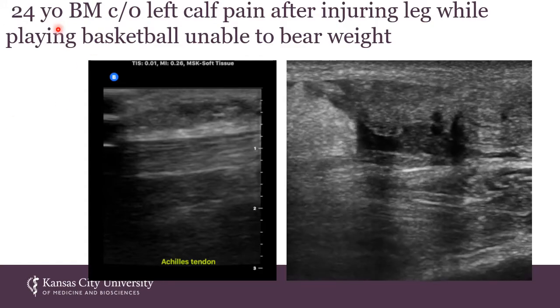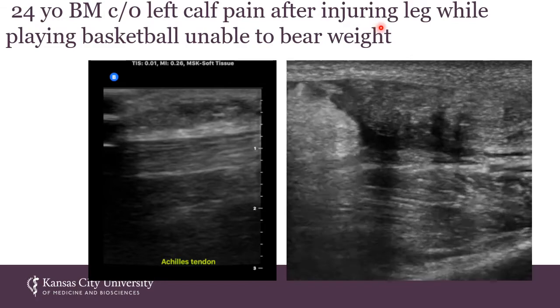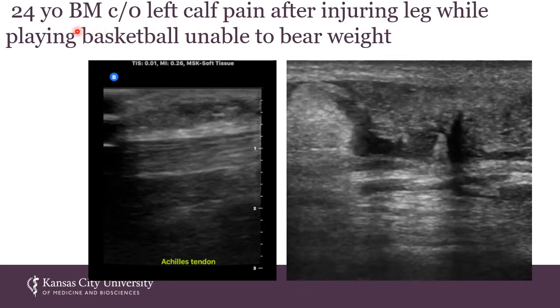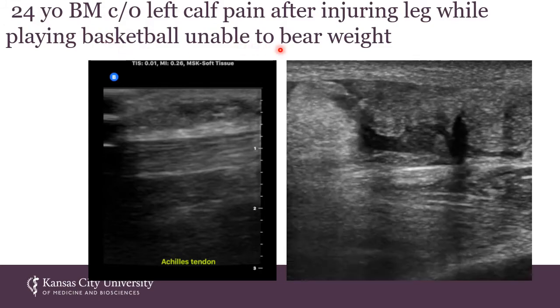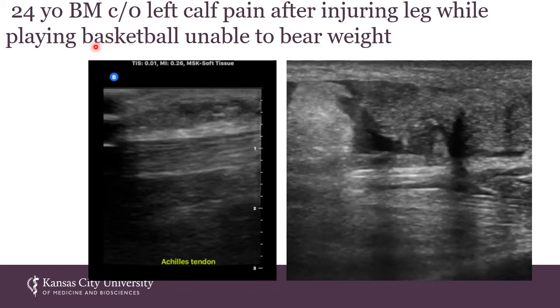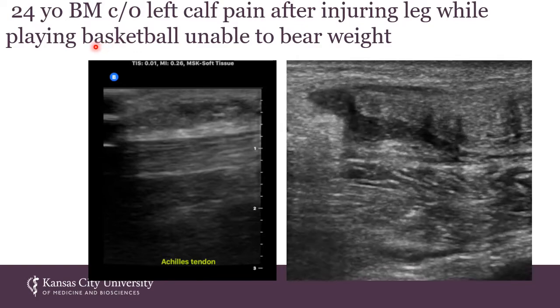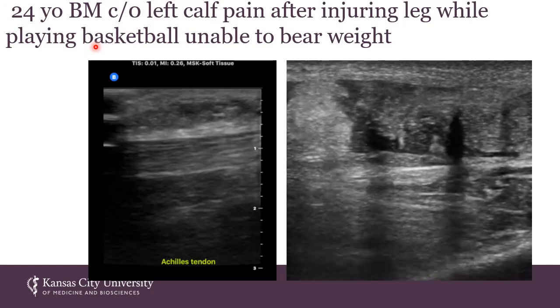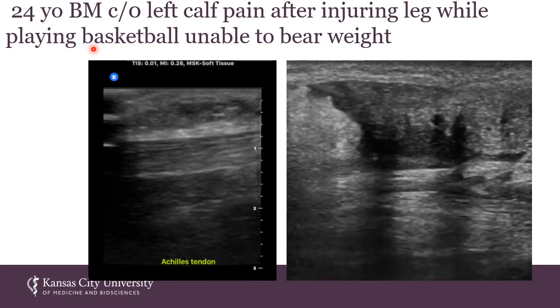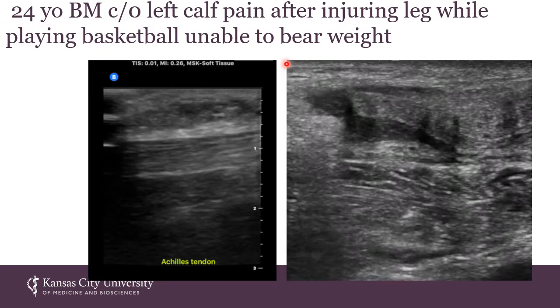So here's another very practical application of the ultrasound. This is actually a case of a friend of mine. It's a 24-year-old black male who was playing basketball and went up for a shot and felt a pop. And I'm going to tell you that pretty much I knew what was wrong with him. I mean, he had pain over his Achilles, and when I did a Thompson test on him, it was positive. So I knew he had ruptured his Achilles tendon. But here's the issue. He didn't have any insurance and didn't want an MRI bill or anything like that. And so I just used the ultrasound to diagnose him with a ruptured Achilles tendon.